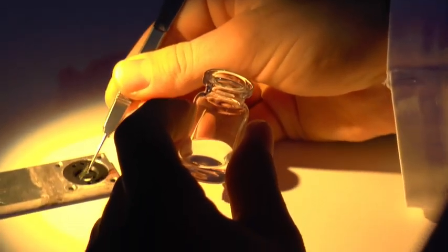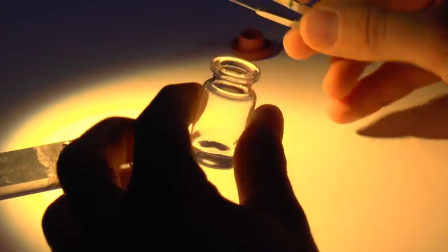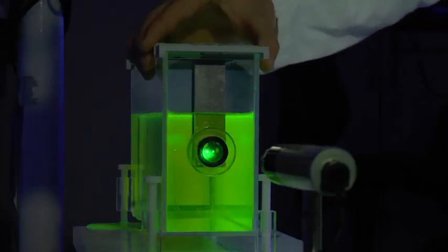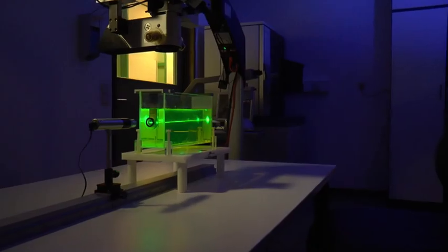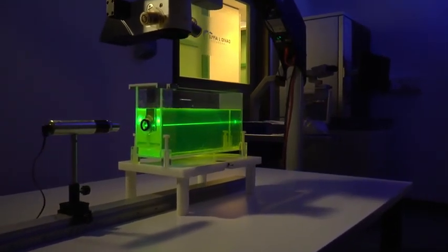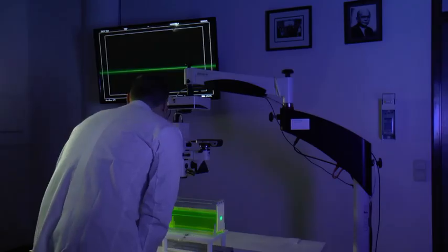The lenses were put in a specific holder and were always kept in the wet state. The images were captured with a digital camera setup. Video films as well as still pictures were assessed.